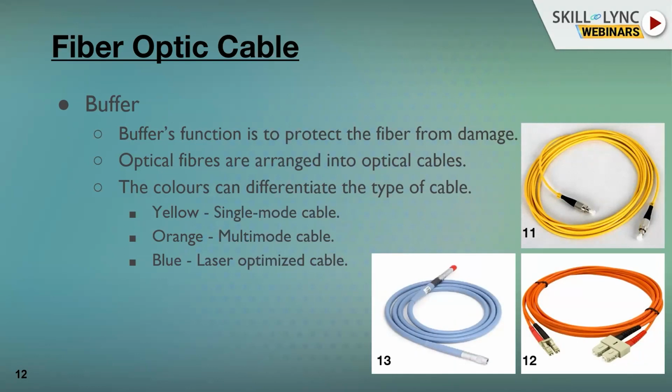So yellow defines the single mode cable, which means only one type of signal can be transferred, whereas the orange has the multi-mode, which means many types of signals can be sent at the same time, whereas the blue one is used mainly for laser based applications.